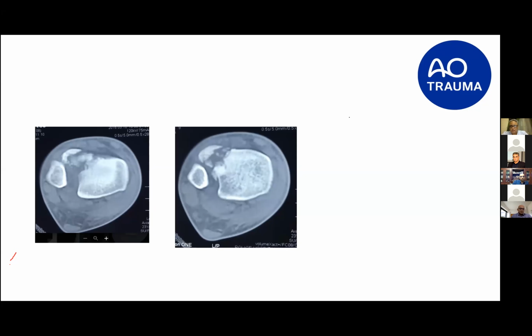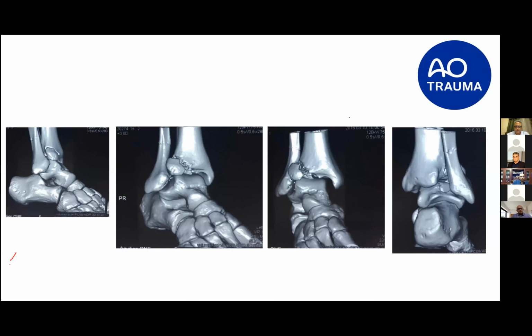And I would keep the scope, use the fluoroscopy views to assess reduction in the two planes, but I would use the scope post-operatively, or after the fixation, to assess my degree of reduction. I think this is a very useful tool. I totally agree with you, Professor Nasef.